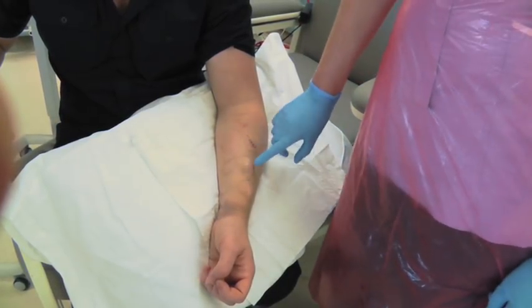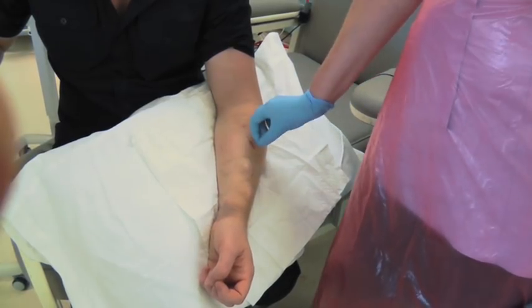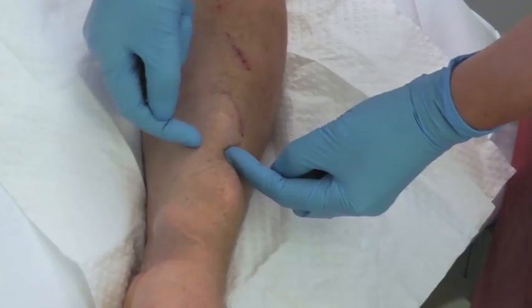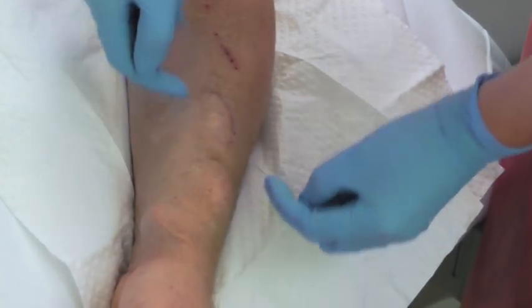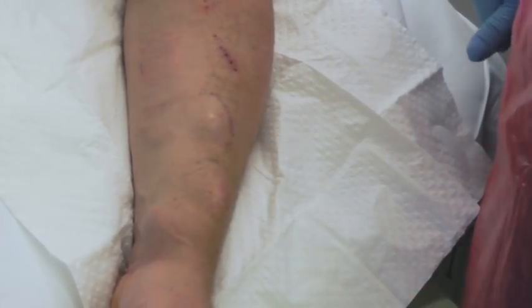If you are going to buttonhole, then buttonhole away from the aneurysm. And if there isn't anywhere else to go and you have to do it, then you can needle right underneath the aneurysm so that the end of the needle goes underneath the aneurysm. But don't ever needle directly into an aneurysm.